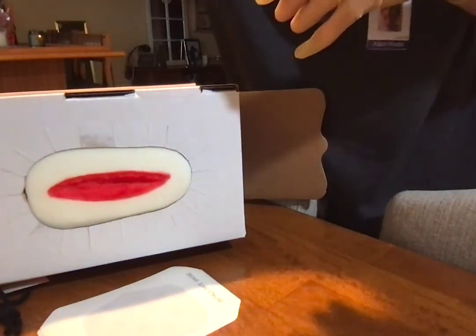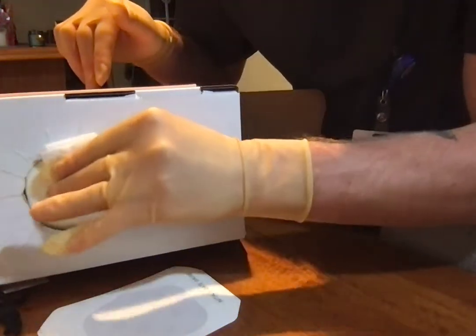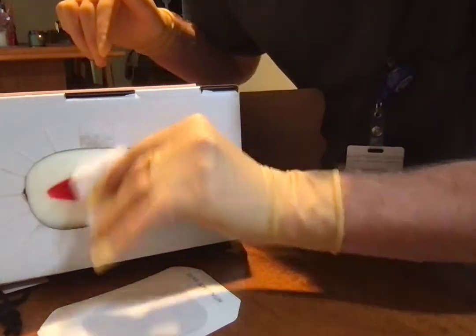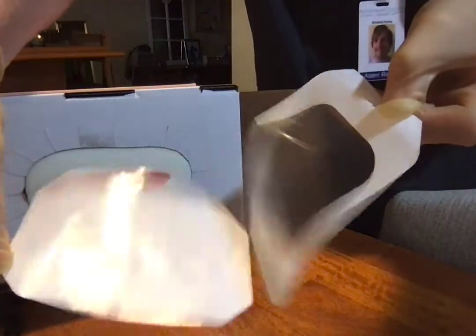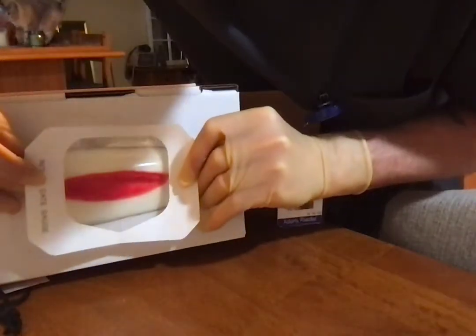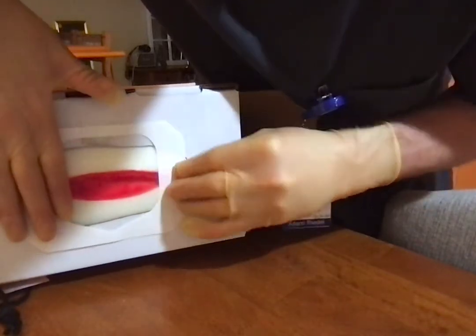And so if that was actual real saline, that would be a little bit on the wet side, and I would want to make sure that I had that properly dried beforehand. So I'm just going to very gently pat the applied area with a sterile or a clean gauze. That way it's nice and dry. And then I'm taking my tape, and I'm going to carefully apply it to the patient here.